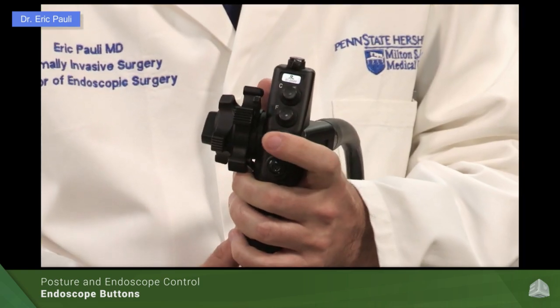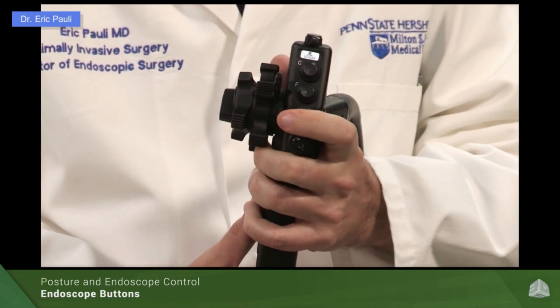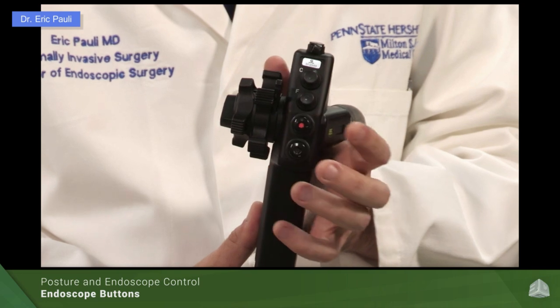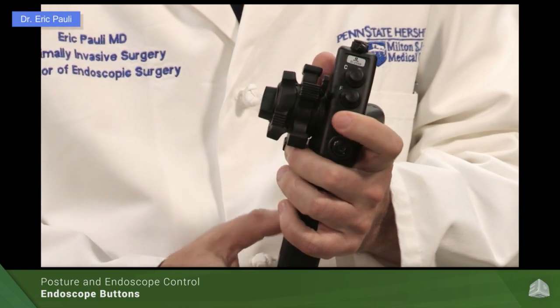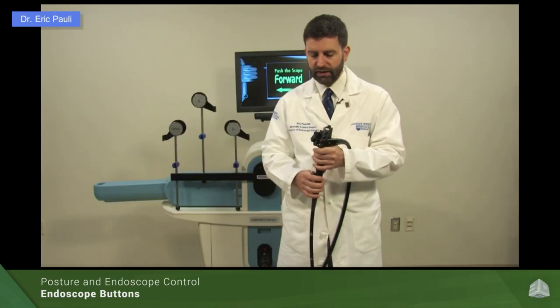The top button is for suction. Depress the top button and that provides suction. You can hold it in, tap it, or work two-handed — you can suck and insufflate simultaneously. For example, if you're underwater and want to clear a puddle, you can suck, but if you don't want to lose any insufflation air, you can tap the air button simultaneously.